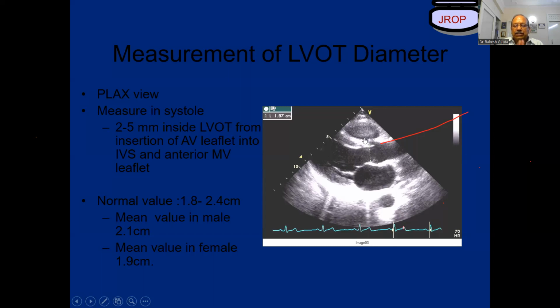Not in every case. Suppose I've got mitral stenosis, I need to calculate mitral valve area by planimetry. Suppose I've got aortic stenosis, I have to look at LVOT diameter and LVOT VTI. You can separate them out, but to begin with, try to do it in every subject, because that will make you perfect over a period of time. Thank you, sir. Dr. Yogendra Deswal.